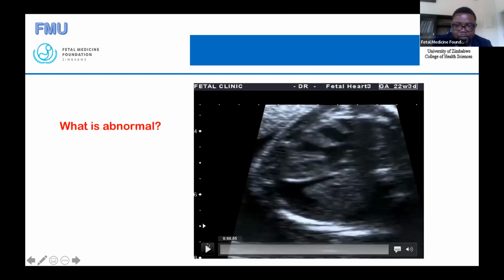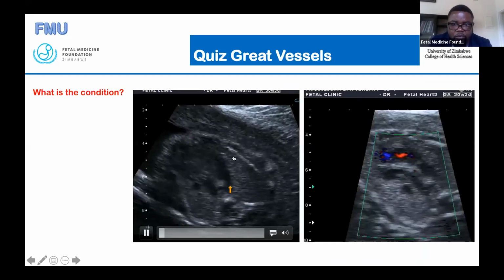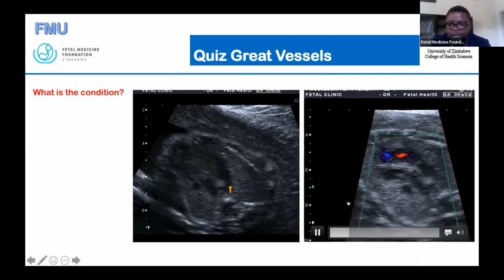Right, there is another one. There is the other one. Oops. What's happening to this one? Oh la la. So this one is refusing to play, but this is the heart. I'm not going to bother you with this one because it's not playing. So I'll jump it. I'll go to the next one. Let's see if the next one will play. Oh la la. So this one is refusing to play again, but let me see the color one. I don't know why these ones refuse to play.